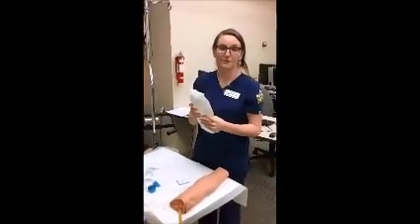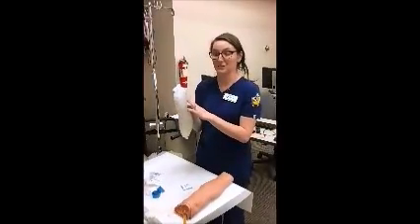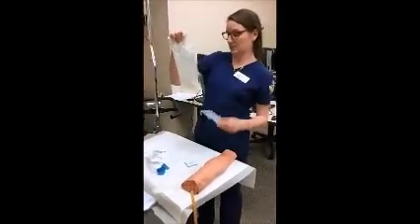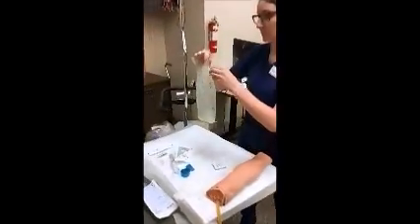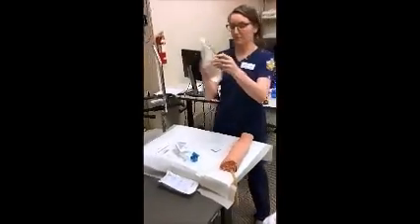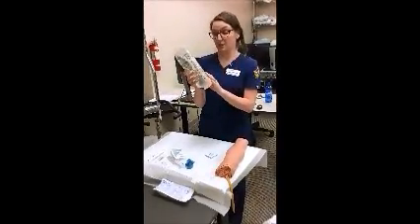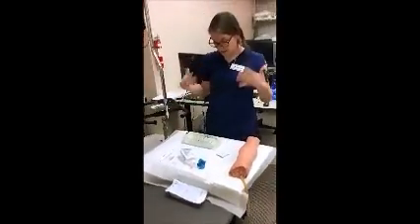In reality, we would have a saline bag that is not out of date. If it was shown as expired, we would go ahead and toss this and find one that had the correct date. So we will go ahead and open that up. Okay. And we can examine for particulates, changes in the bag, changes in the color of the solution. We want it to be clear. We want to see no cracks in the bag, no discoloration, nothing odd like that. Okay. So on this, now we're going to start preparing this.